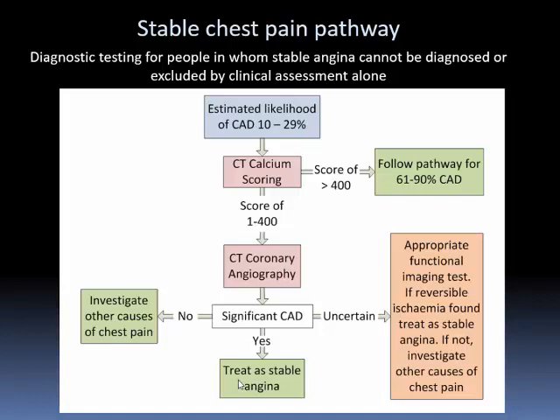Okay, I've touched on NICE, so just to rehearse what NICE says. The first thing NICE says is that you should be using CT angiography in the intermediate group. In other words, you're not using it in high-risk patients. Although they recommend doing a calcium score and, with a calcium score of 0, discharging, that's a bit more controversial. Taryn will show you data to support that argument.